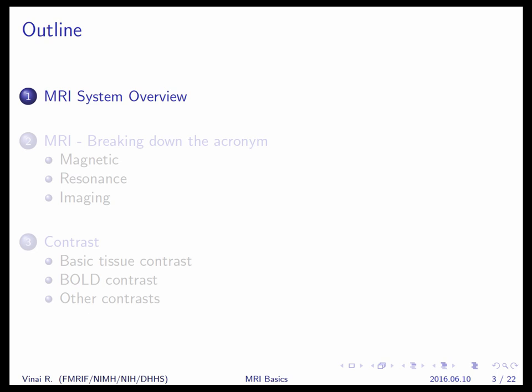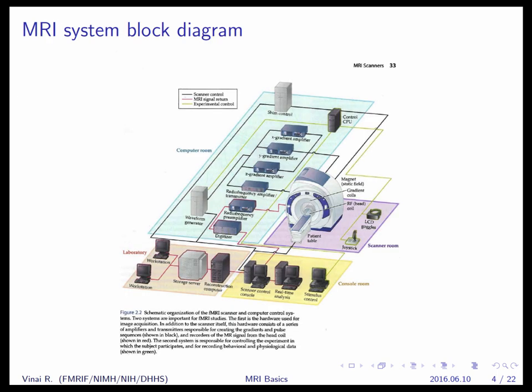Okay, so for most of us, this schematic should be fairly familiar. Almost everybody should have seen the magnet. It's hard to miss. So this is where you set up your patients. This is actually where the experiment is done in terms of collecting the data, where it's generated. You may also spend a little time in the control room. So you run the scanners from here. Your stimulus may be set up there.